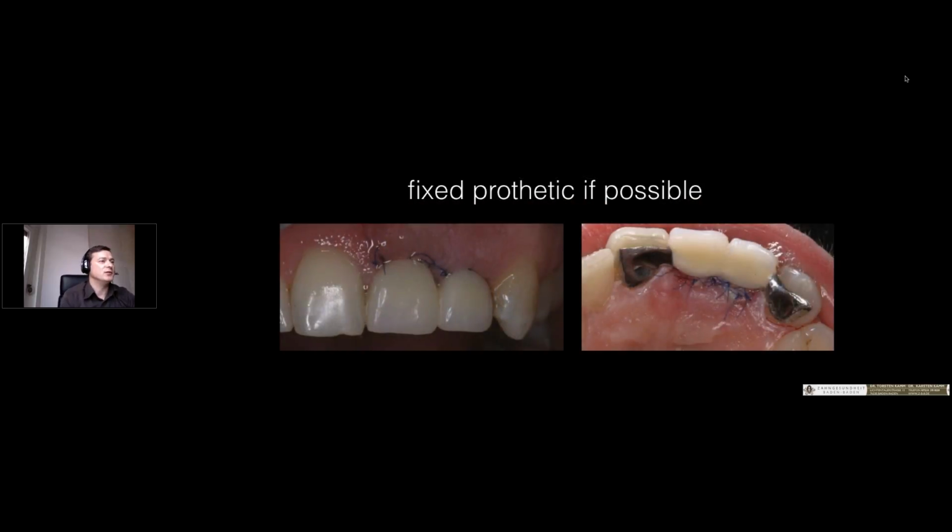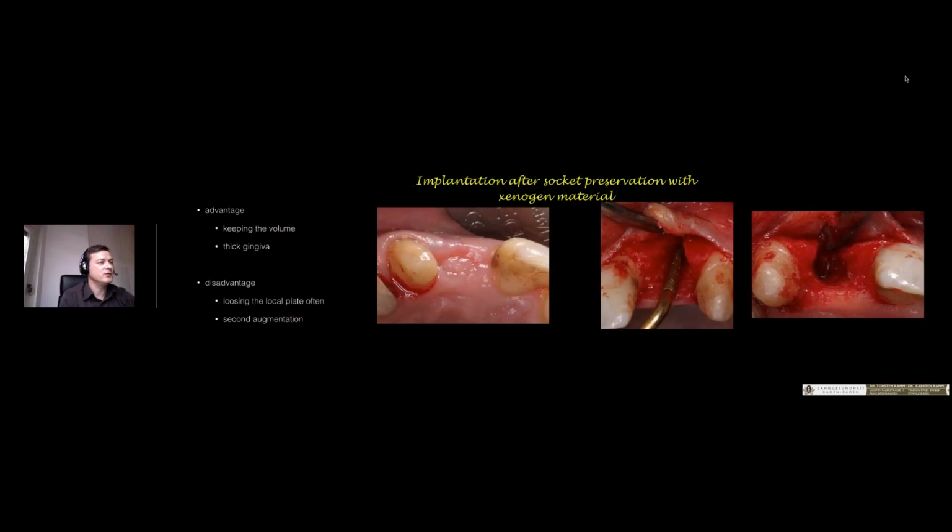And this is the result. And we always want to cover it with a Maryland bridge, like seen in the picture, to get no pressure inside the transplantates. And here you see the results.